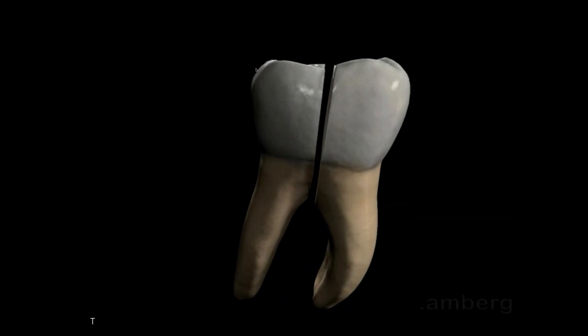Here I'm taking a 557 long surgical burr, sectioning, making sure I'm through, and then taking my physics forcep.